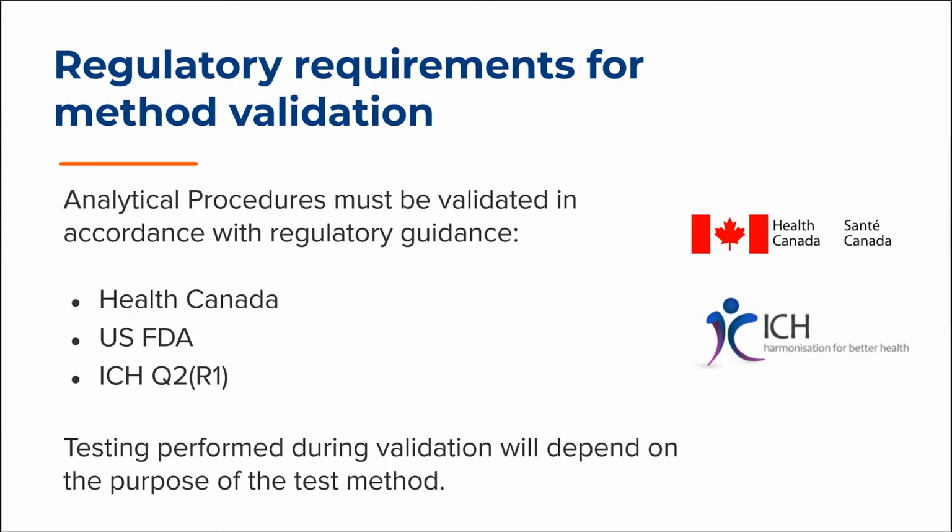It should also be noted that the ICH has recently issued a concept paper to update Q2 in conjunction with the release of a new Q14 for analytical procedure development. However, since Q2 R2 is not official yet, we will not cover it in this webinar.